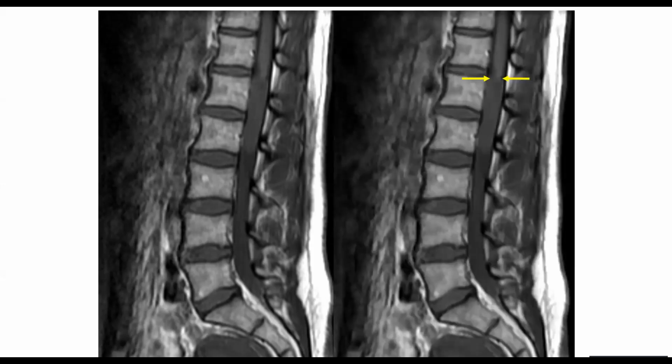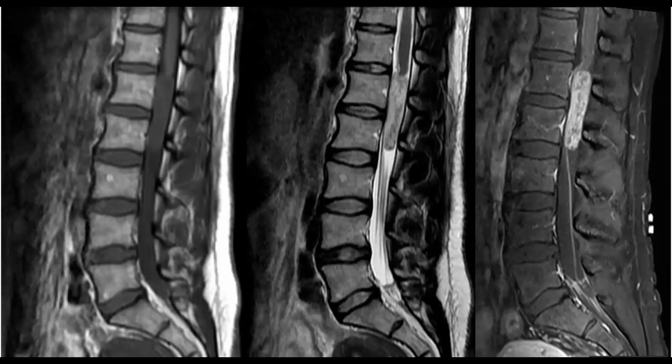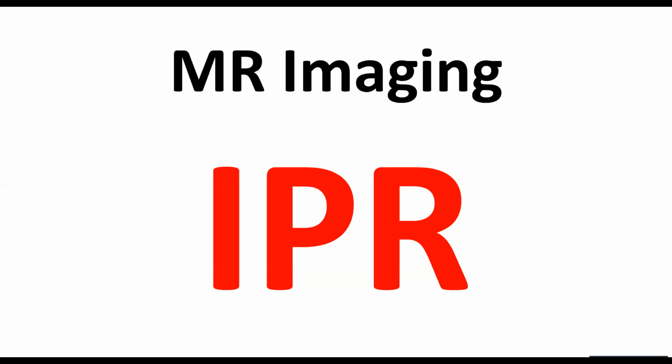Okay, and again, just showing the arrows, the transition, and there it is. 3 different scans, 3 different sequences. It just occurred to me, how did this make the conference? All the cases I present, as everyone knows, are from this past week or 2 weeks, since the last time I gave the conference. I didn't dig these up from a study set. They're not coming from the literature or anything like that. These are all recent cases, and looking at that scan on the left, it just struck me how invisible that tumor would be if you didn't already know it was there. And I thought, well, let's make a challenge out of it, and then we can make it easier and easier and easier. All right, did you like that? Okay, let's try another one. I really enjoyed that. That was a lot of fun for me.